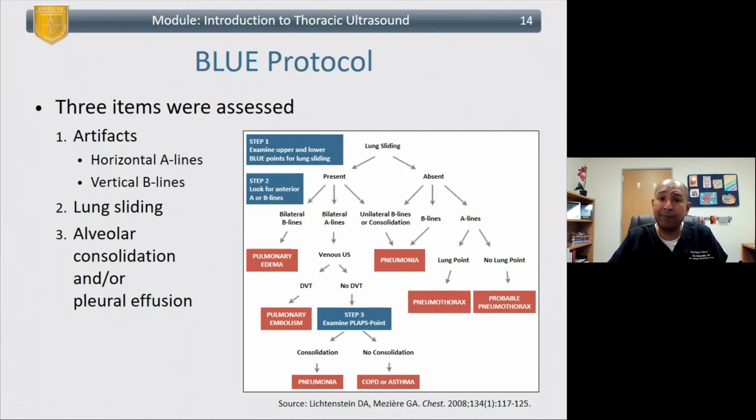A lines are so tricky because you naturally have A lines, and you could have it with a pneumothorax or without. So it's really not going to be a deal breaker over there, and we'll talk more about those, and we'll talk about terminology. If you don't have lung sliding, probably the most accurate image you want to find is called lung point to really say as close to 100% as possible, is there a pneumothorax or not? And we'll talk about it.